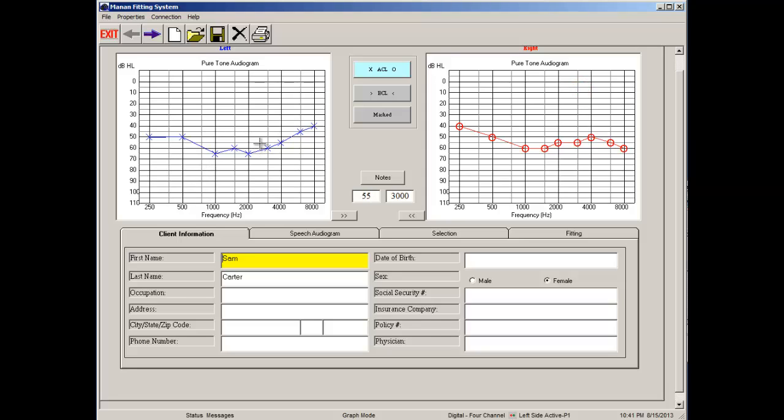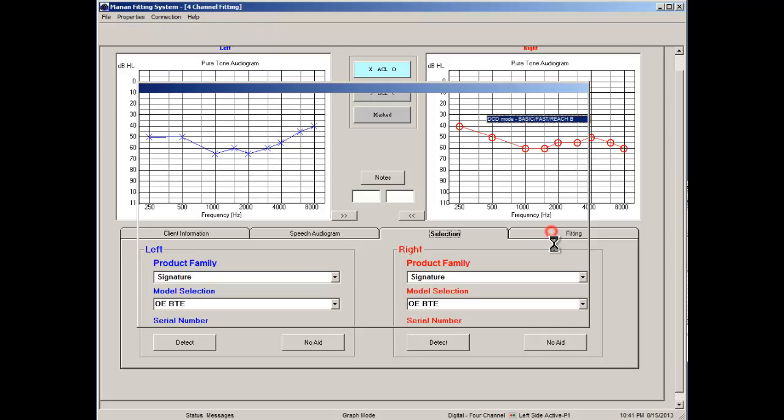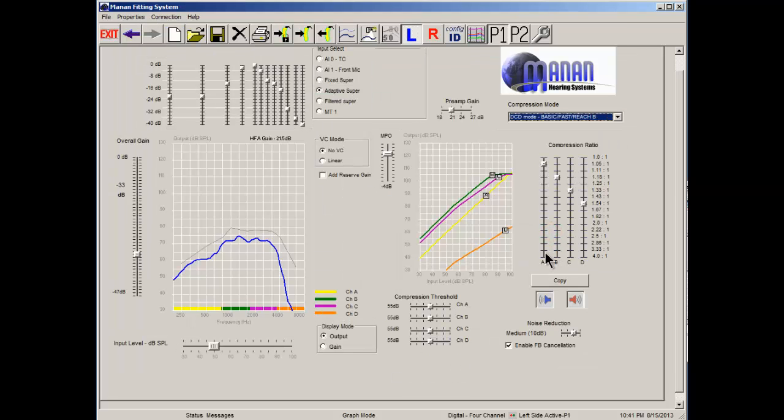And then you can see that it went ahead and opened up the information that we're looking for. So you can see that Sam has his left and right audiograms there, and his name is now present. So the next step is you're going to go to the selection tab. You're going to detect your hearing aids, and then you're going to go into the fitting tab to work with your hearing aids. Now, when you want to bring old data back into the hearing aids, effectively like restoring your information, this is how you're going to do it.